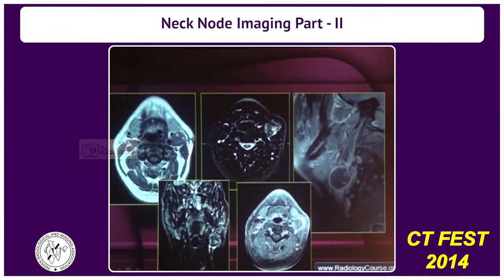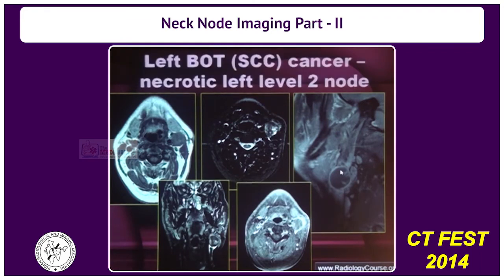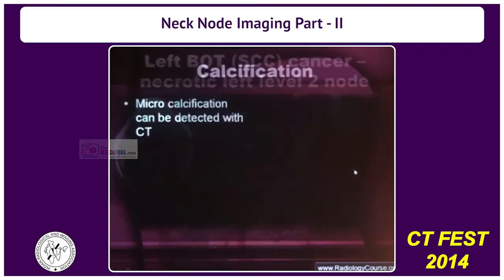Another patient has a necrotic node on the left side showing rim enhancement following contrast — this is a floor of base of the tongue tumor with a necrotic level 2 node. They can sometimes be purely cystic, and occasionally you will see solid areas. But even if it is purely cystic, don't assume it is tuberculosis or something treatable — in cancer, this is something we should not miss.